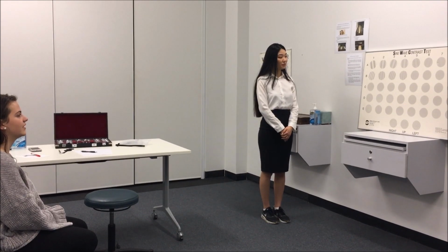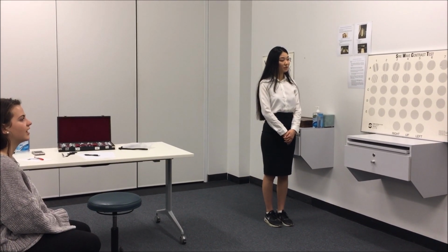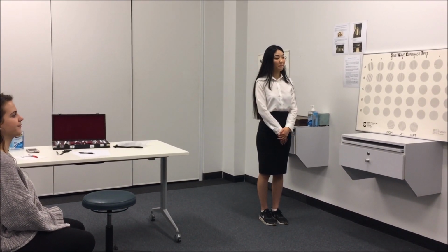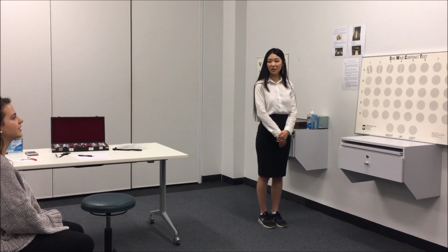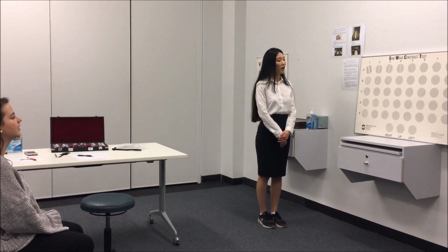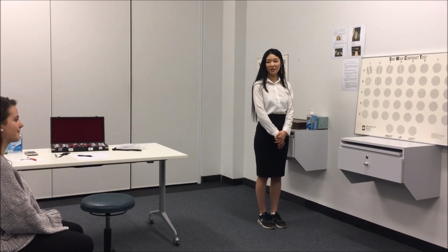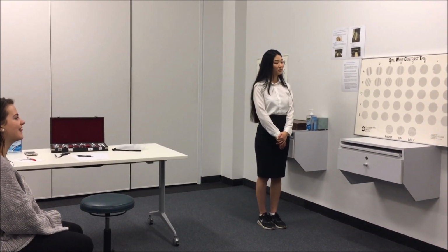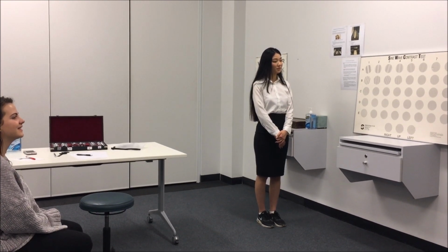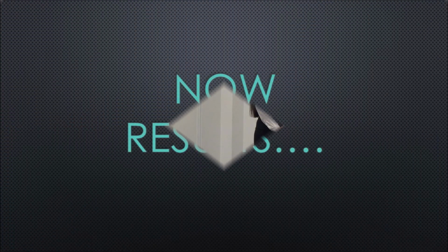Right, left, right, up. And I'm not sure about the next one. Okay, now going back to the patch on the left to confirm it. Yeah, up. And then the one after. Maybe up, but I'm not sure. Okay, that's alright. So we'll just continue to row C. Up, right, left, up, right, up. And I'm not sure about the next one.